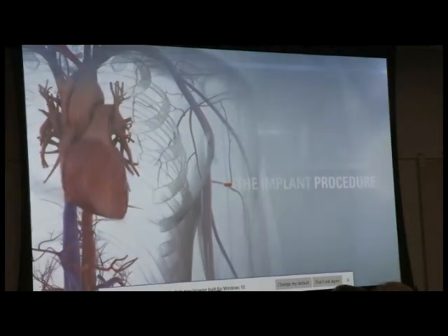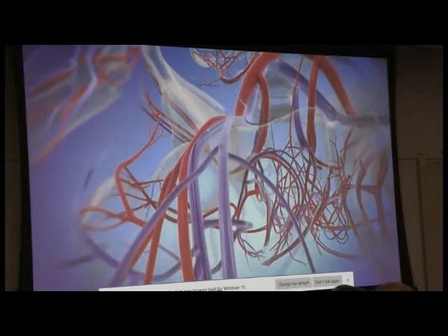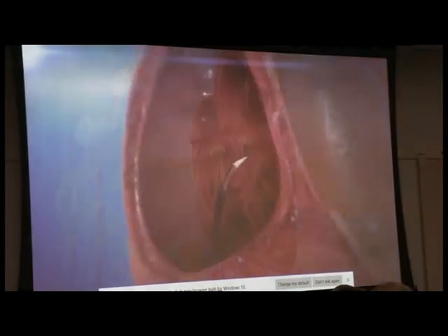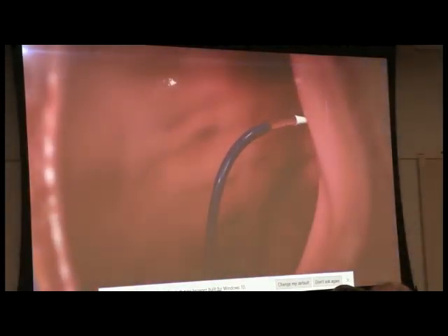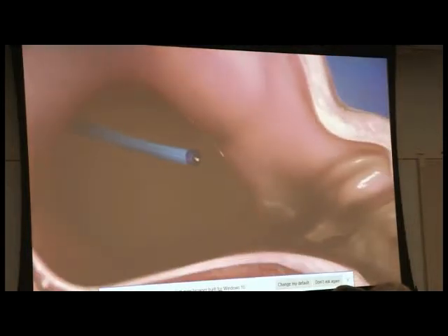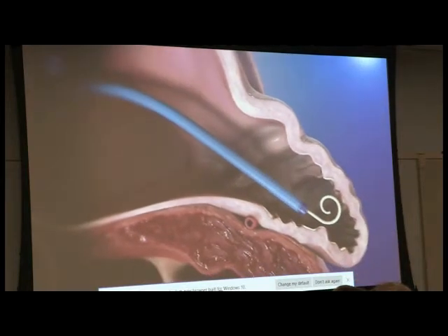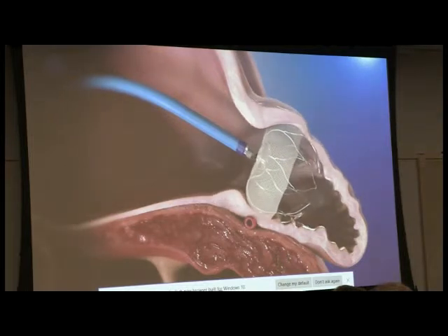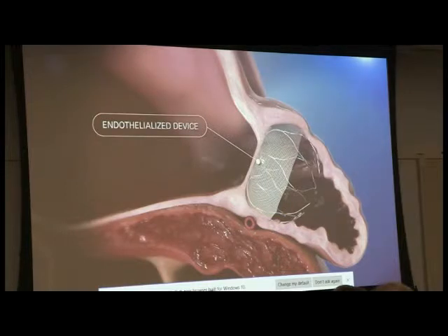Using a standard percutaneous technique, the implanting physician inserts a guide wire and vessel dilator into the patient's femoral vein. Then, using a standard transseptal access system, the physician crosses the interatrial septum. The physician advances the access sheath over the guide wire into the left atrium and navigates it into the distal portion of the left atrial appendage over a pigtail catheter. The physician then deploys and releases the Watchman device. The device gradually endothelializes to permanently seal off the patient's LAA.